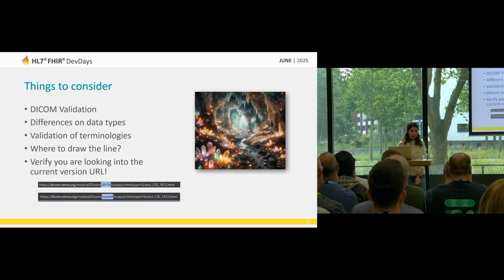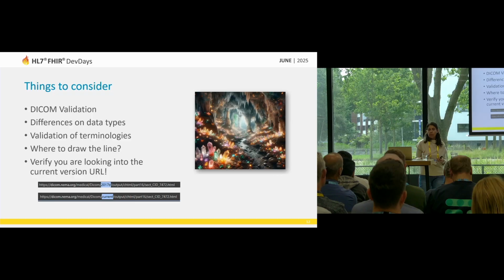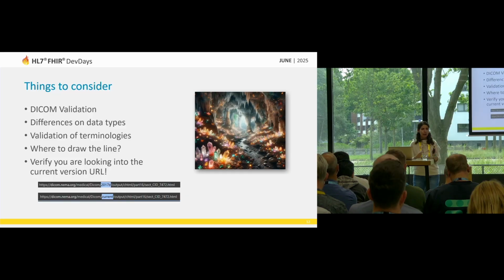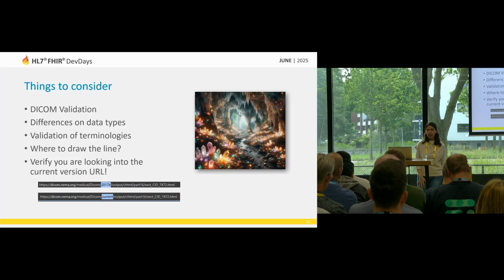And as I was saying, you can write extensions to put more information there. But where do you draw the line? You don't want to repeat the standard. DICOM is already quite good, but you really want to also take the meaningful things out. So it is really not clear where to stop when you can extract data from DICOM.